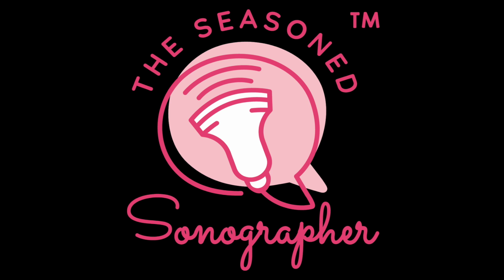You need to distinguish that pseudosac from a true intrauterine pregnancy. Make sure you're seeing that double decidual sign. If you see a sac with no decidual cast around it, no yolk sac or embryo, and it's irregular, it's probably a pseudosac, a pseudogestational sac.